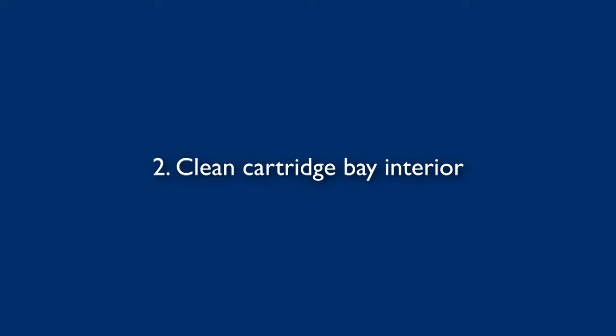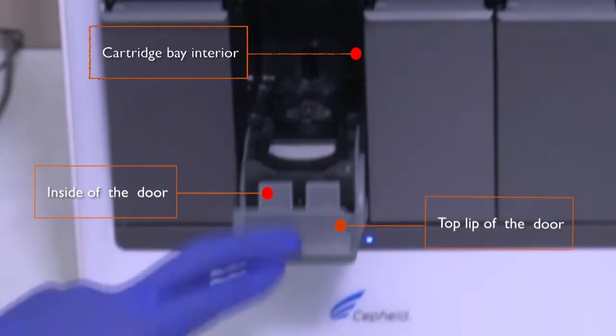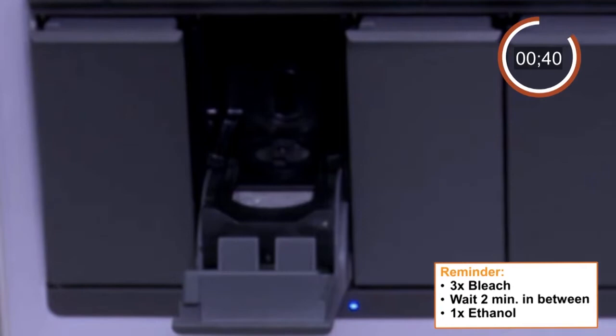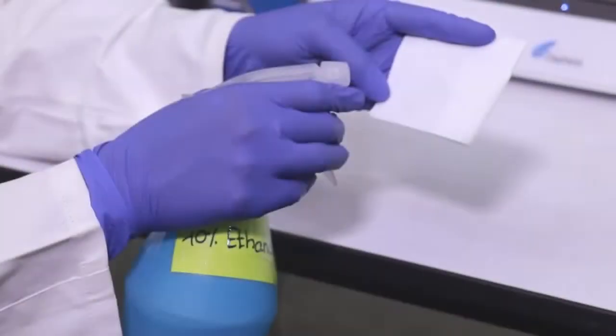Next, we will continue demonstrating the procedure for disinfection of the cartridge bay interior. As the first step, moisten a lint-free cotton swab with 1% sodium hypochlorite solution and wipe the cartridge bay interior surfaces, inside of the module door, and the top lip of the door with that swab. Take care not to touch the slot on the I-Core module into which the cartridge reaction tube is inserted, as getting liquid inside the I-Core module can damage the module. Wait for 2 minutes. Repeat cleaning of cartridge bay interiors 2 more times. Then moisten a lint-free cotton swab with 70% ethanol solution and wipe the same surfaces. Finally, close the module door and discard the used paper towels.